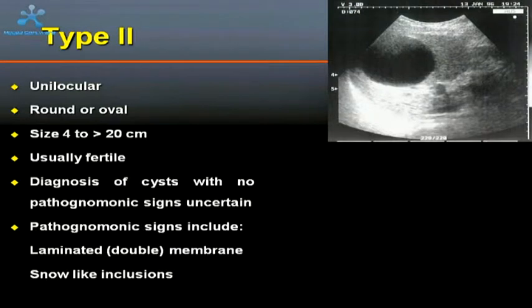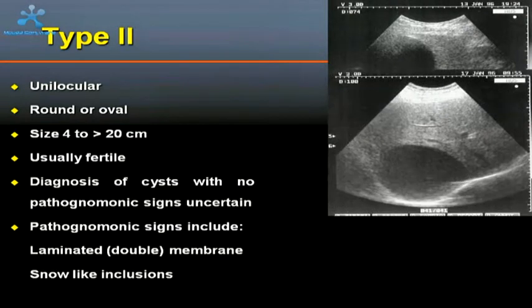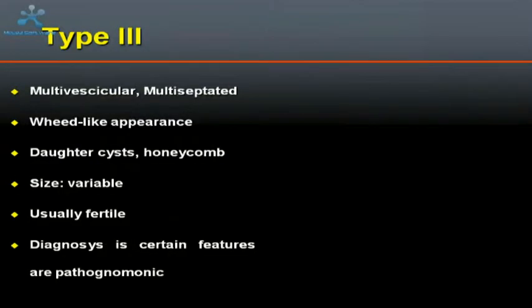It is very fertile, probably the most dangerous hydatid cyst that we can meet in the liver. The diagnosis, in the absence of material inside and in the absence of detachment of the inner membrane, is very difficult. This is usually the aspect that you can encounter.